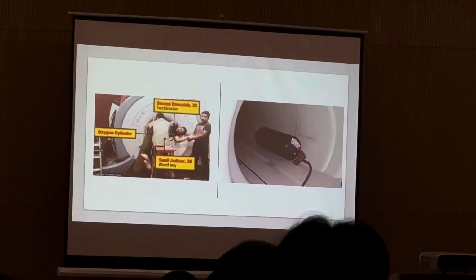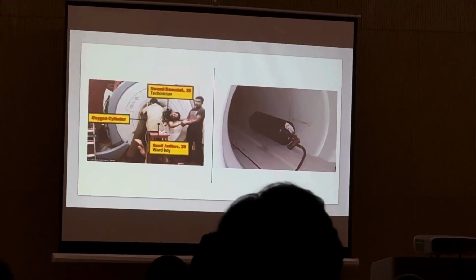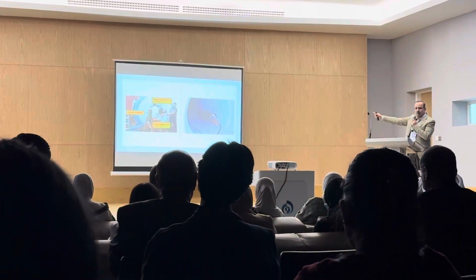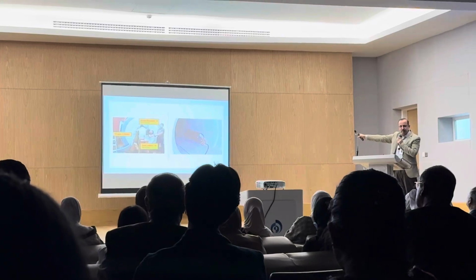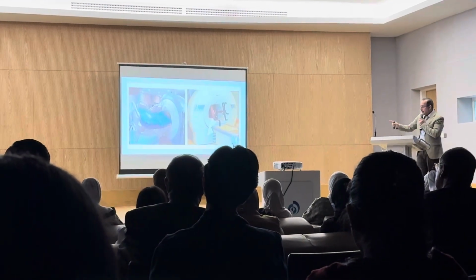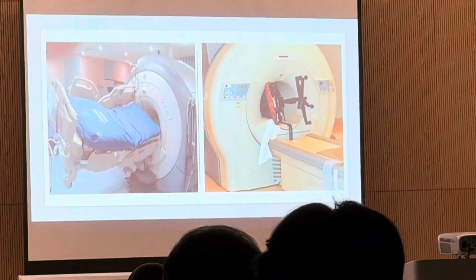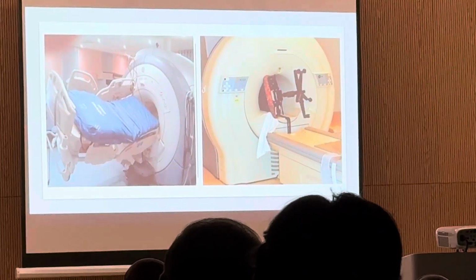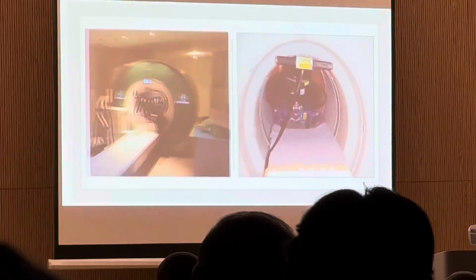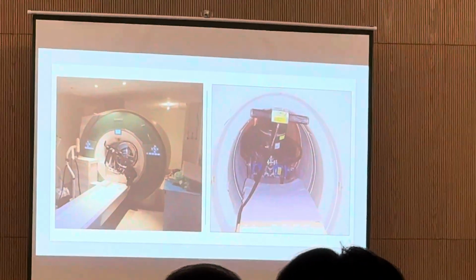They will go into something else, which we'll call later, which is quenching and immediately terminating the magnet to save his life. The second is, luckily no patient is there. Look at this small oxygen cylinder which is hanging and fixed into the wall of the magnet bore. Imagine this is going as a bullet or a projectile material attached to the bore of the magnet, and imagine this chair hanging in the front of the magnet bore, and also this wheelchair and this cleaning trolley that could be present in the area.